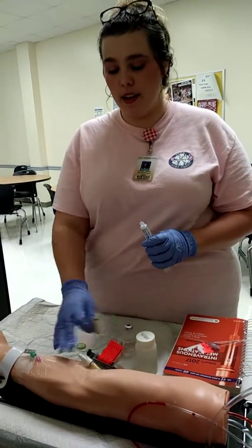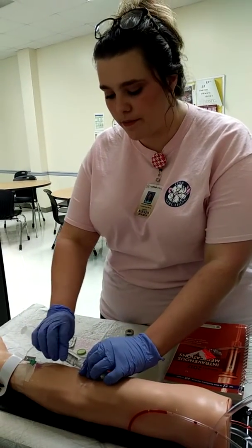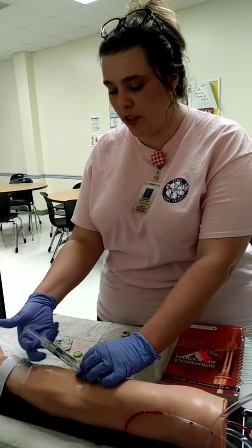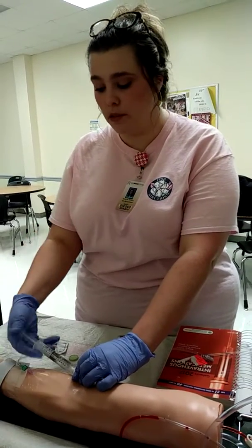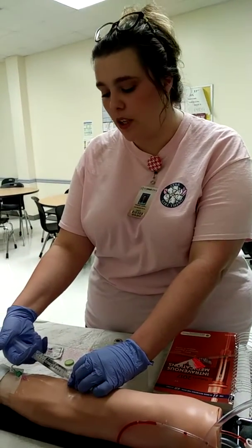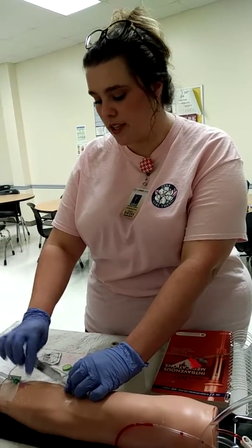Now with the INT, I'm going to make sure I flush it. So I'll connect it, and I'll flush over the same push method. I'll draw back, make sure I get blood. I got blood, so I'm going to push it out. We're good. That's flushed all the way.